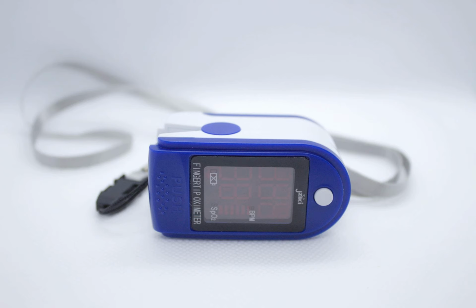So, what do we do about this? The idea is, potentially if we have somebody who is not white, has darker skin, and their SATs are reading maybe borderline like 91, 92%, but they don't look that great, we should question, is the pulse ox actually accurate? It's pretty relevant in the day of COVID, where we're making a lot of decisions on who needs to be admitted, who needs home oxygen, who needs pretty advanced treatments based on a pure pulse ox reading without paying attention to a lot of things like how they look.